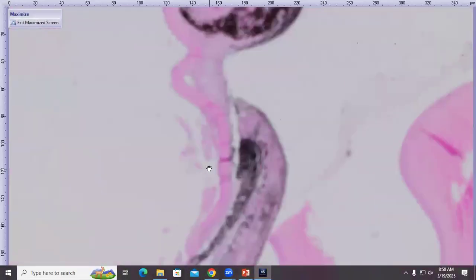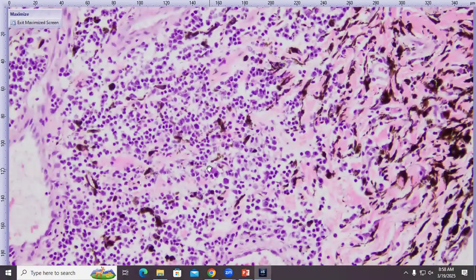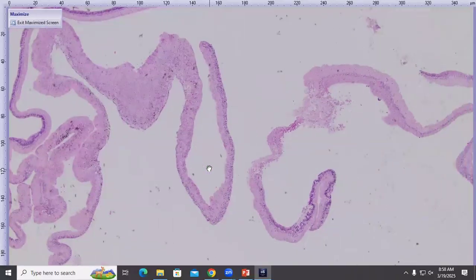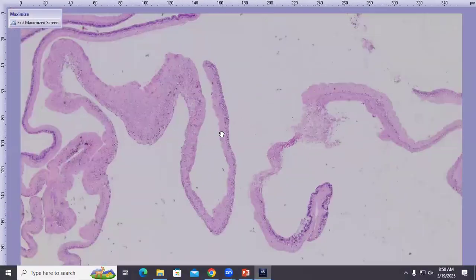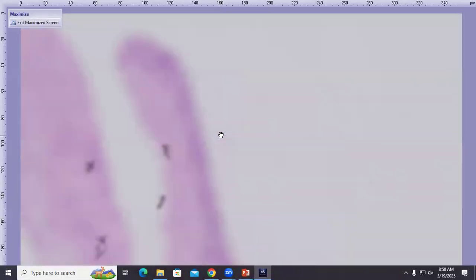We'll run back over here really quick and drop in on this purple area just to show off that it is inflammation. So yeah, here's an anterior uveitis, lymphoplasmacytic. And the last thing that I'll show in this case is the retina, which is detached and pretty severely atrophied, often full thickness. It's a wild ride. And then also multifocally torn.